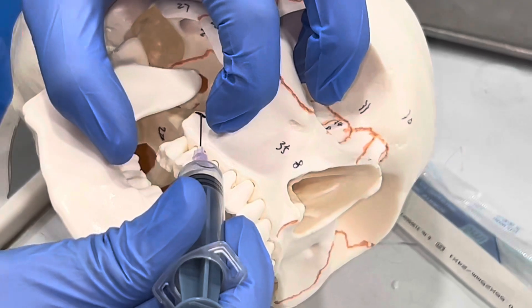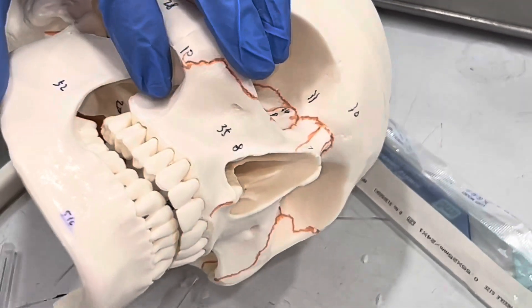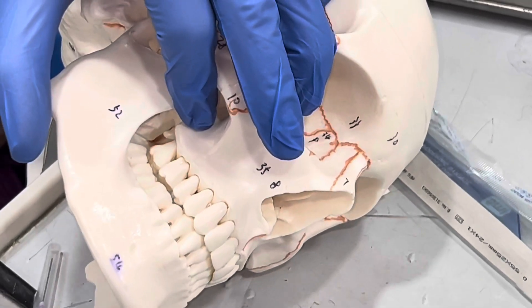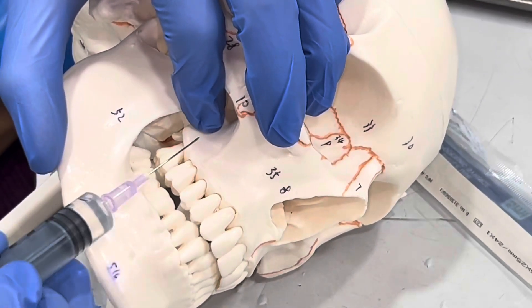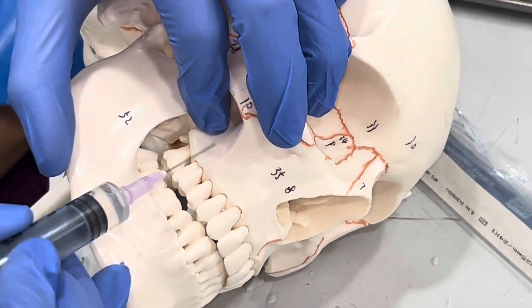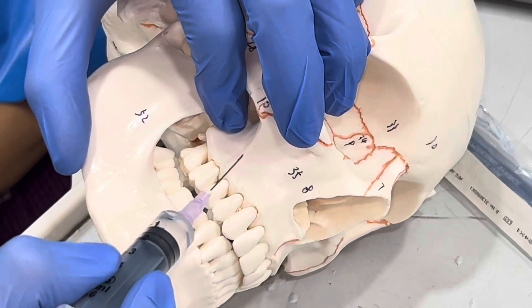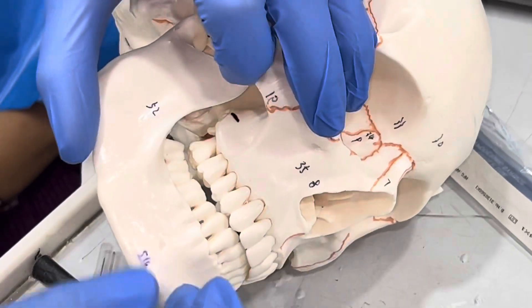This is our target area. After removing the needle, we always compress this area with our finger so that there is no hematoma formation. Please remember: if you want to anesthetize the first molar for a root canal treatment, you will have to add local infiltration at the mesio-buccal root apex. The mesio-buccal root of the first molar will not be anesthetized with the PSA nerve block, so you have to give some local infiltration in that area. That will be all for the PSA nerve block — cheers.